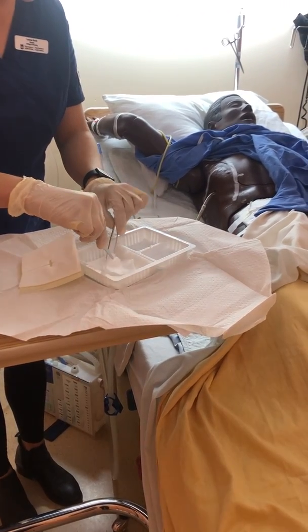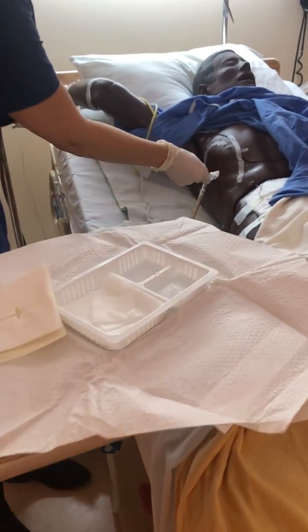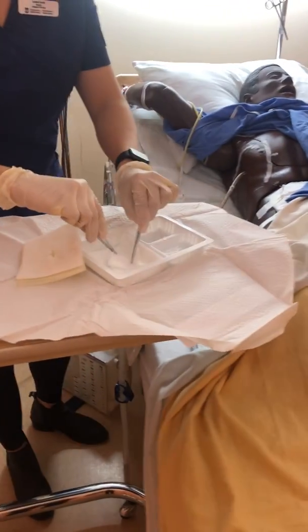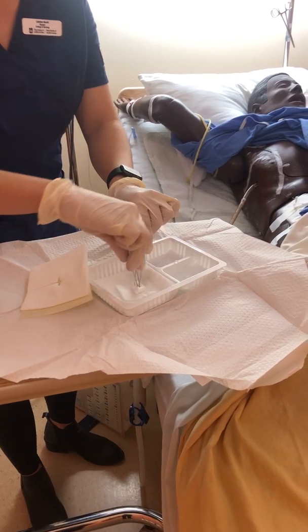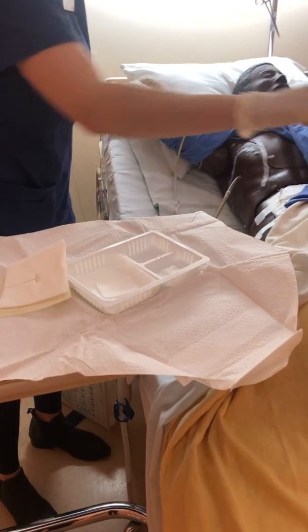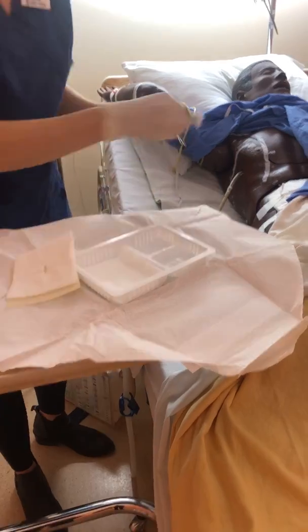Gauze wants to be stubborn today, so it's sticking all together. Okay, another a little bit further around. And I would keep going around on the skin until everything is cleaned and dried. I'm going to go down the tube here once. And then again underneath the tube here.